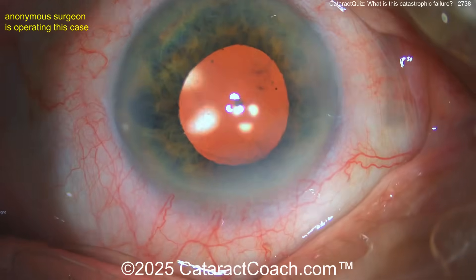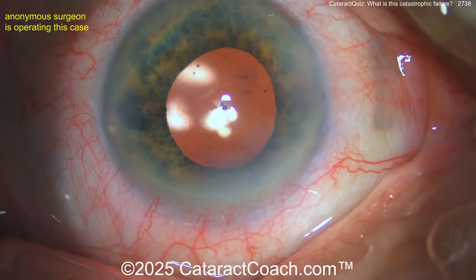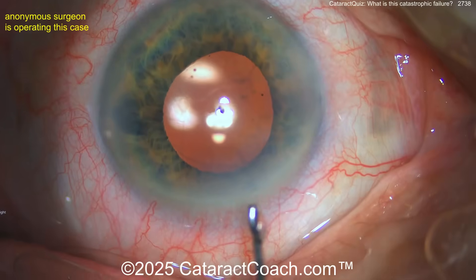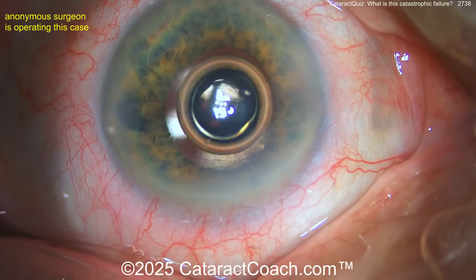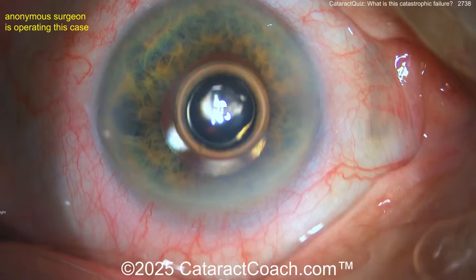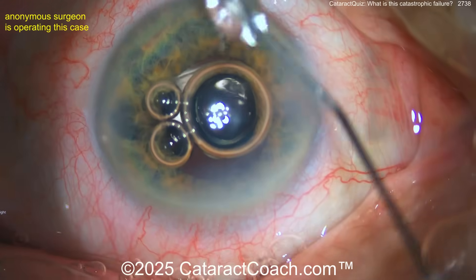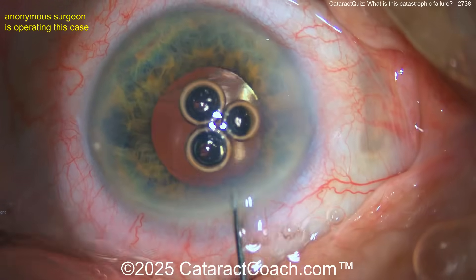It's to the left of the Purkinje images, so you've got basically at least 60% of the Descemet's membrane detached — 60%. You keep looking because you're thinking 'oh my god, what am I going to do?' The answer is: go through the left paracentesis. The bubble needs to push Descemet's back up. But injecting from the wrong side is pushing Descemet's further away from the stroma.